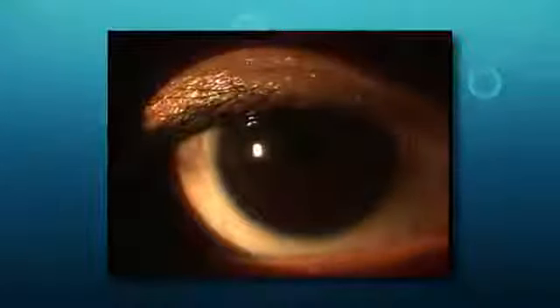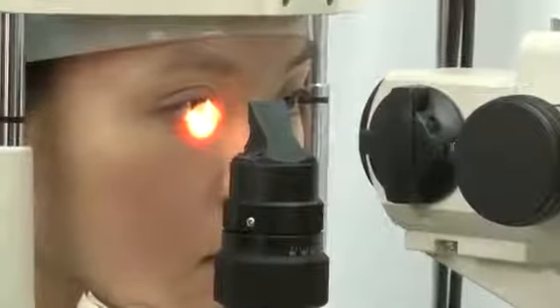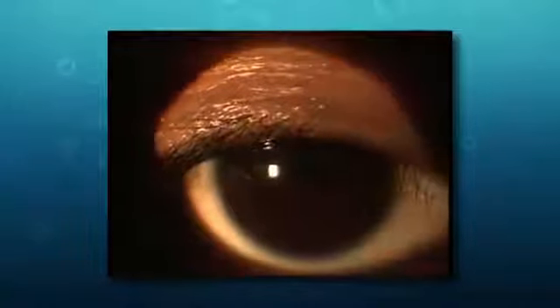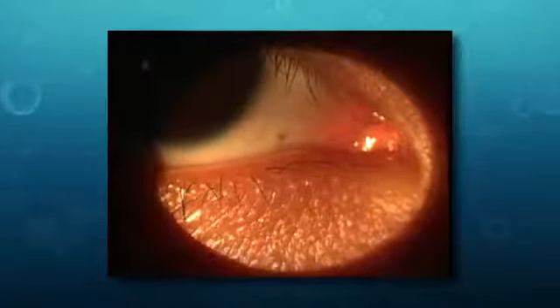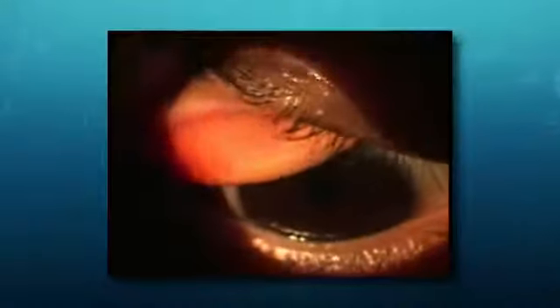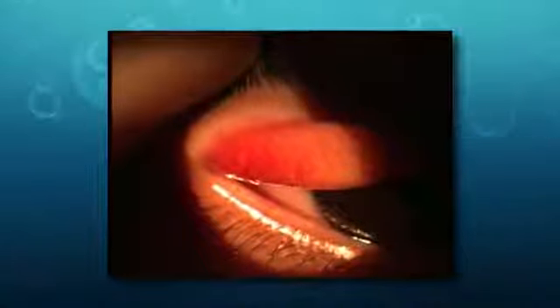Diffuse illumination provides an overall view of the external and anterior segment of the eye, for example, cornea, conjunctiva, sclera, eyelid, eyelash, and tear film. It is also useful for examining the lower and upper palpebral conjunctiva. However, to prevent the tear film from becoming unstable, eyelid eversion is better performed at the end of the anterior segment examination.